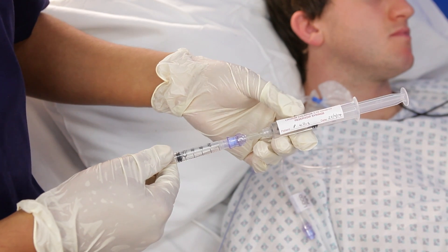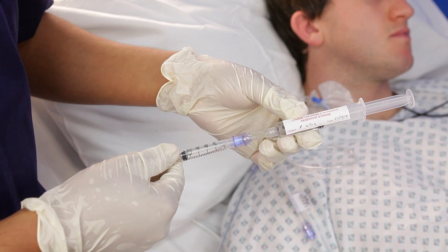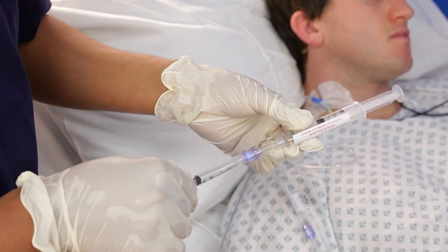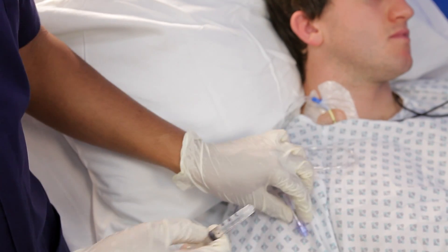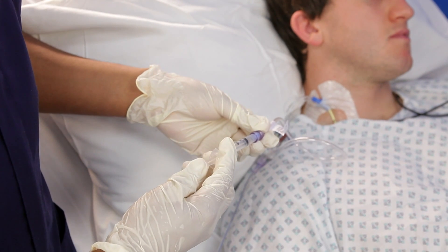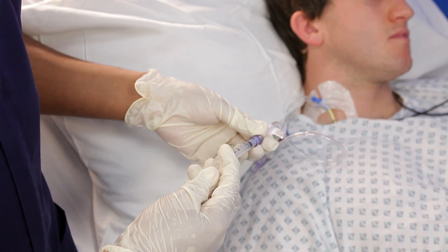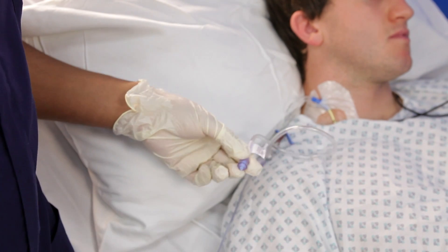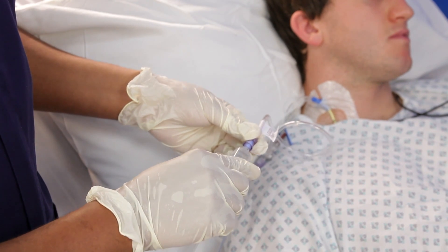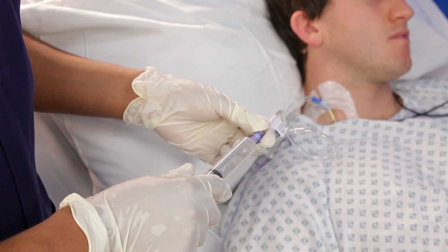Draw up a dose of lithium chloride using the 2ml syringe. Before injection, ensure the CVC does not contain a pharmacological or therapeutic infusion. Now inject the lithium chloride into the Park and Ride tube. Make sure this is accurately drawn up so that you have consistent results. You are now ready to attach a 20ml syringe filled with saline to the Park and Ride, ready to administer the lithium chloride dose.